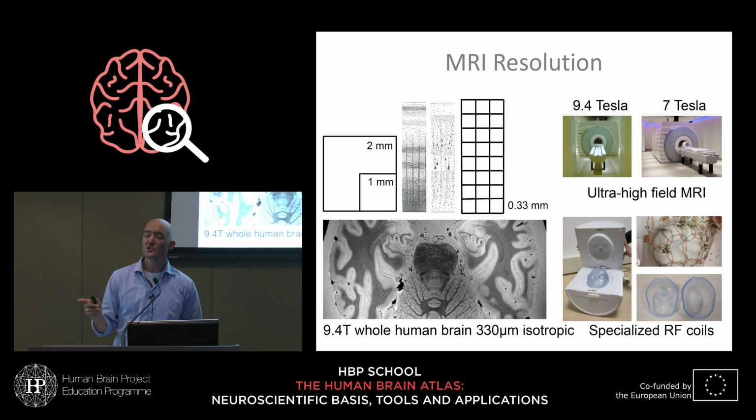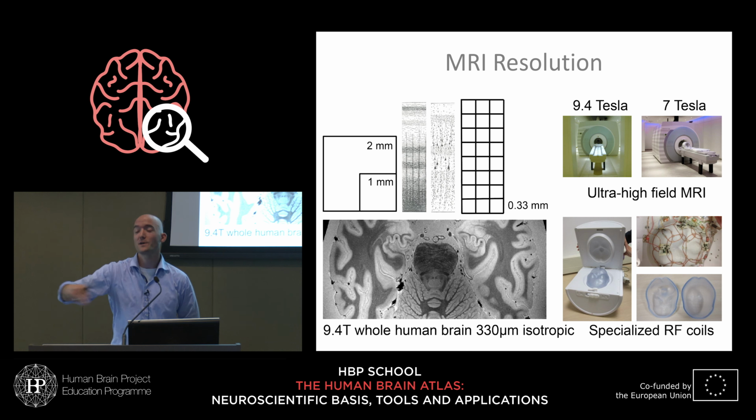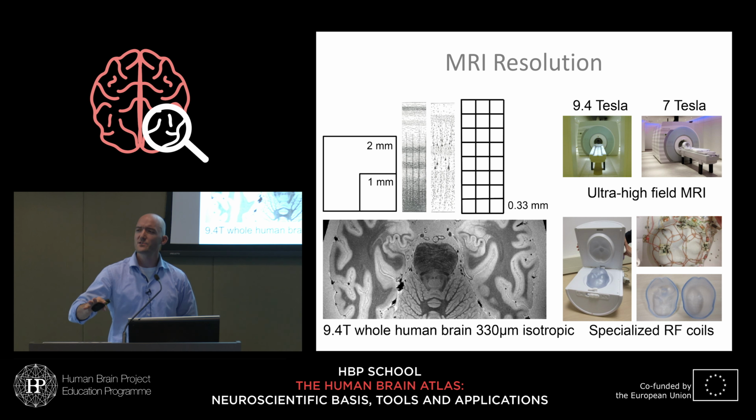That's both a consideration and not. Where it's not, we don't do a lot of parallel imaging in post-mortem. Because parallel imaging, as you know, if you do a multi-band or GRAPPA, you cut your measurement time in half, you also cut your SNR in half. And I just told you how badly we need SNR, so we're not going to sacrifice it again to do parallel imaging, not in most of the cases of what we do. So this is unaccelerated imaging, which makes the whole noise story easier. You're completely correct that it gets complex when you do parallel imaging.